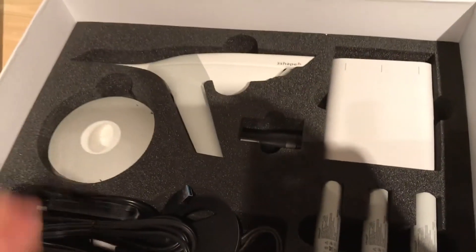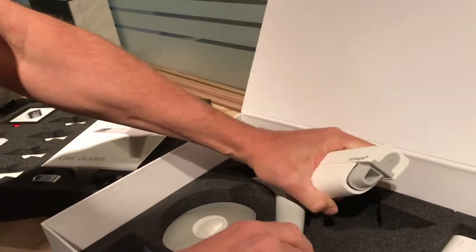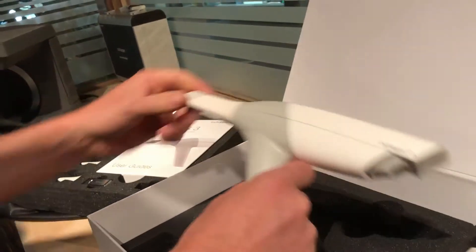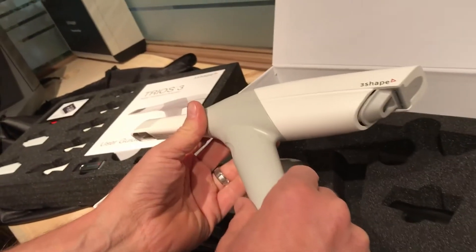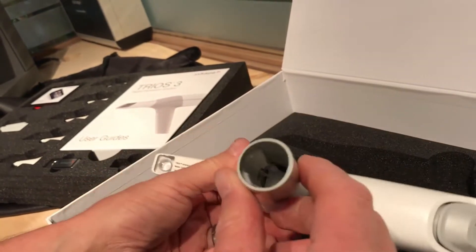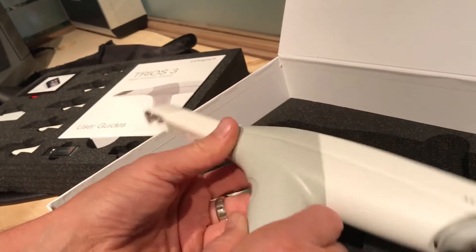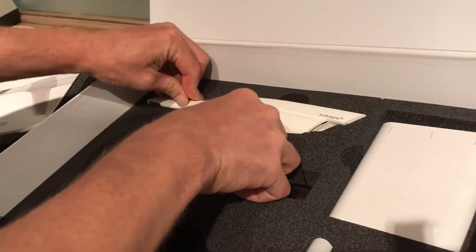Now, as we can see, this is very different. We have the Trios 3 wand, and of course this is the first production unit that's out. This is the pistol grip, and you can see at the bottom there's the spot for the lithium battery. And then you have your travel tip here.